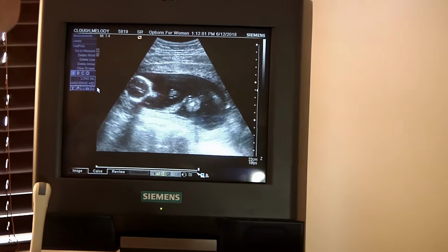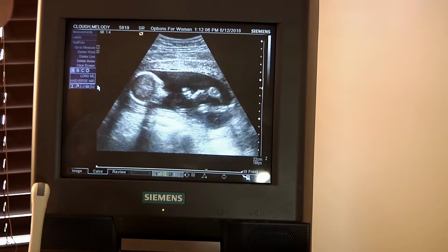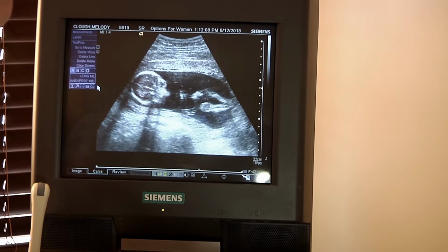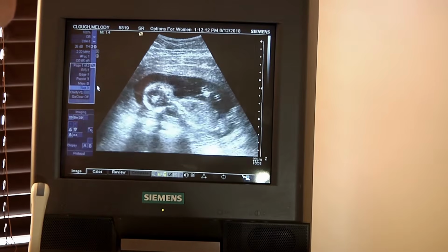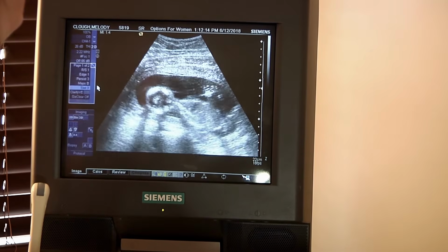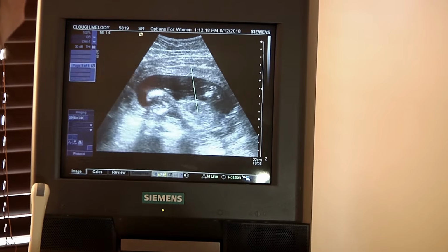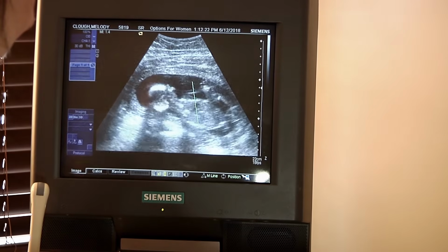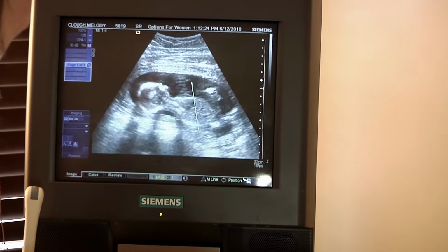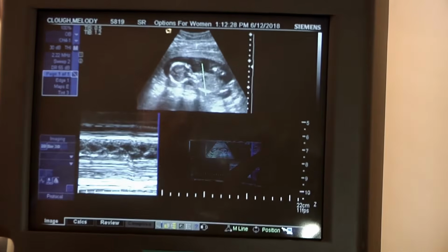Oh my gosh, that's too funny. All right, we can go get some. Want to go for the heart? See if she's... Hurry up. Okay, you got it. Freeze.